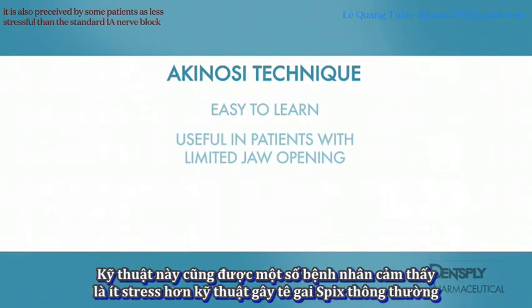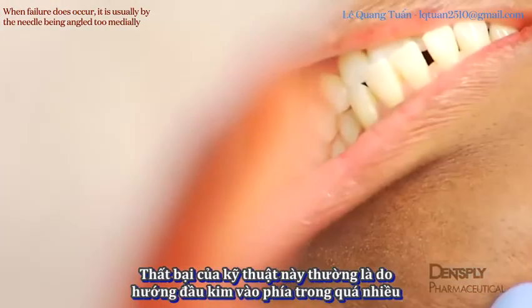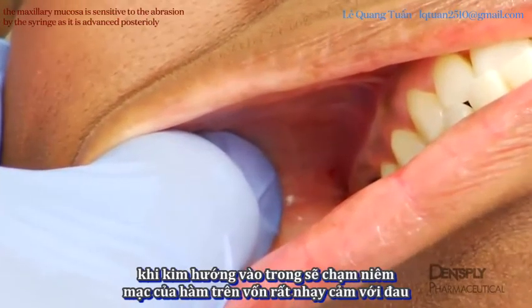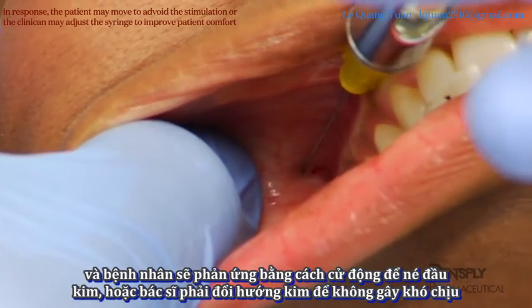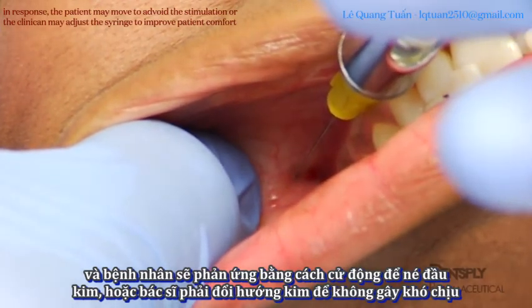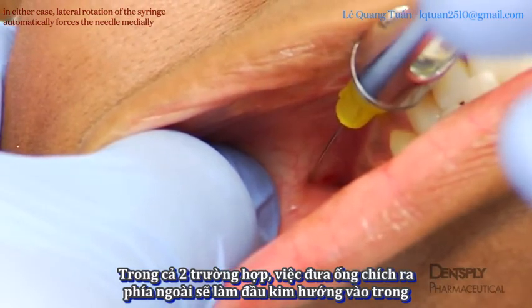It is also perceived by some patients as less stressful than the standard inferior alveolar nerve block, yet comparable in onset time and anesthetic efficacy. When failure does occur, it is usually caused by the needle being angled too medially. The maxillary mucosa is sensitive to abrasion by the syringe as it is advanced posteriorly. In response, the patient may move to avoid the stimulation, or the clinician may adjust the syringe to improve patient comfort. In either case, lateral rotation of the syringe automatically forces the needle medially.